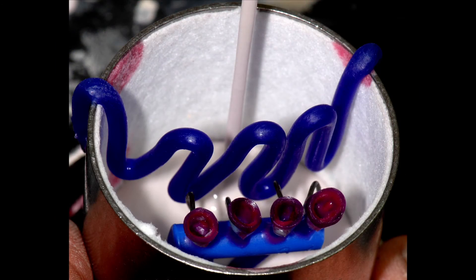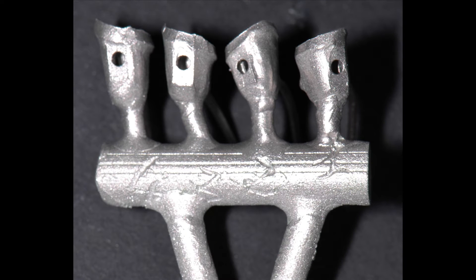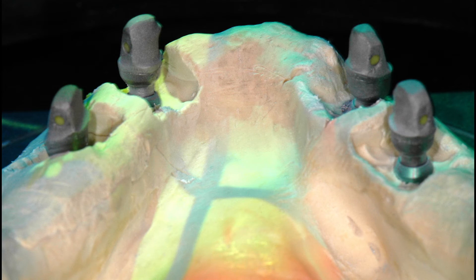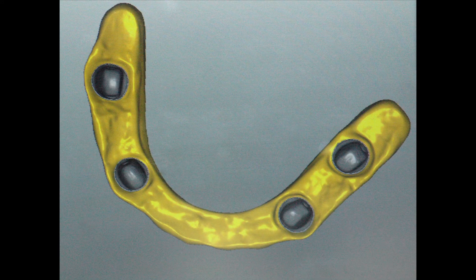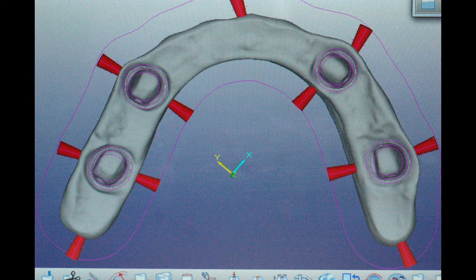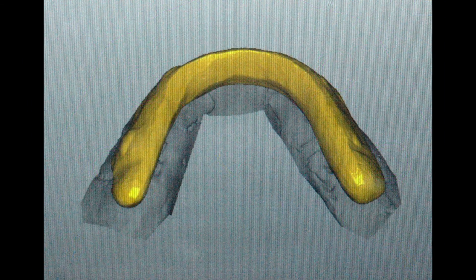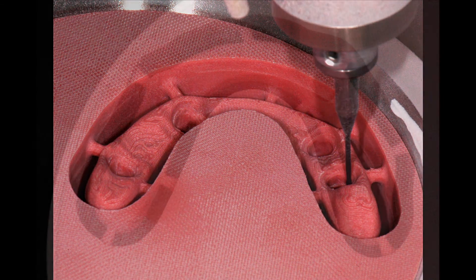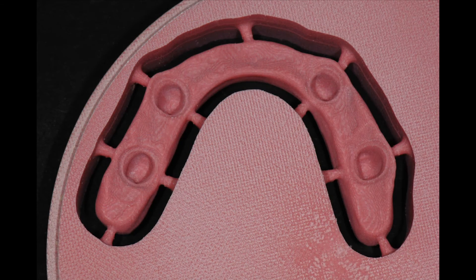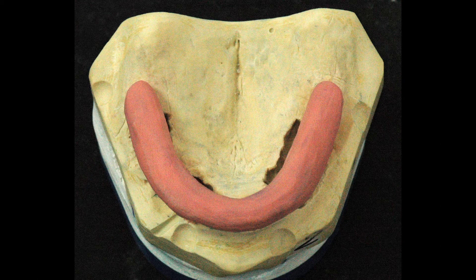The eight waxed copings were invested and cast in a chrome-cobalt alloy. After the chrome-cobalt copings were fitted to the milled abutments, they were digitally scanned along with the resin bar. The scanned images were digitally combined and the final TRINIA substructure was designed and milled from a pink TRINIA disc, prior to being fitted and seated onto the cast telescopic copings on the models.